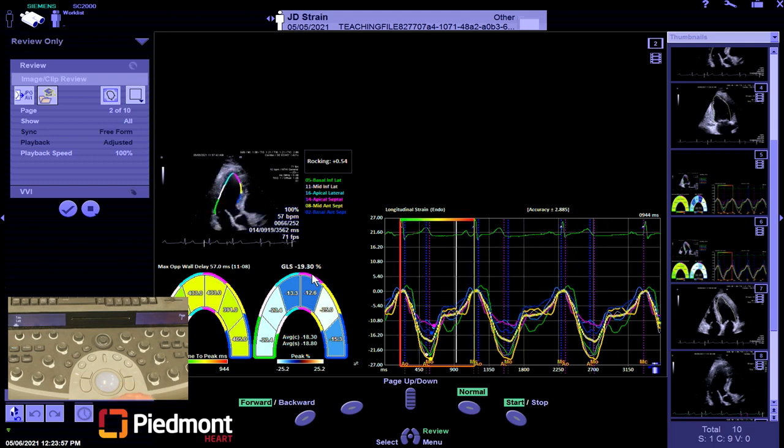We've already touched on the R2R, reason for R2R retrospective capture. So can you turn on the R2R without an EKG? And the answer, as we saw, was no. You must have an EKG in order to turn on your R2R intervals. Why should we acquire apical images consecutively? Well, as we also stated, acquiring the images consecutively allows for both consecutive heart rates at the similar or same gain settings, depth settings, and sector settings. That way there is the least variability between all three views.